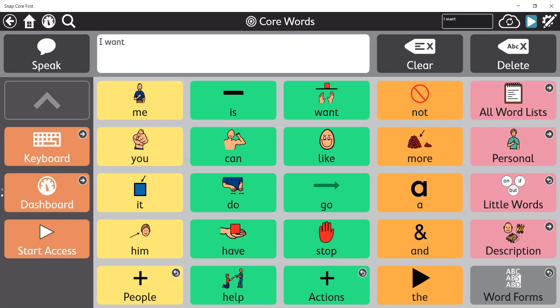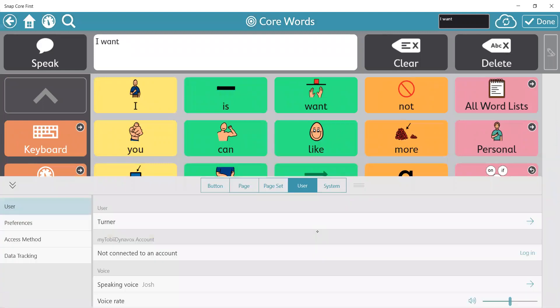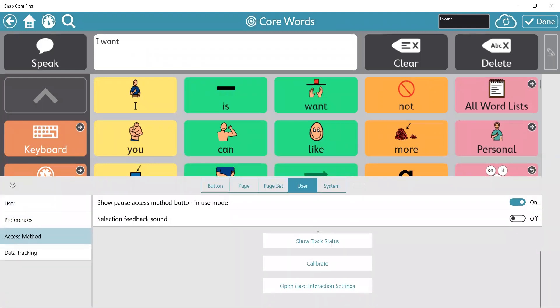That's how I would do my settings within Snapcore First. If you haven't already calibrated, I recommend opening that setting through user, access method, and scrolling down to calibrate.